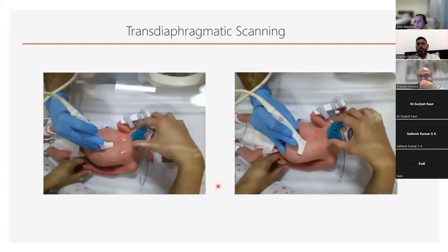Yeah. Okay. So just another example. Again, so this is the left shoulder. So my marker, unfortunately, is towards the left shoulder. It should be the opposite way. It should be pointing towards the right shoulder. Do you get what I'm saying? So we need to turn this probe around 180 degrees so that the marker, which is this end, points towards that shoulder. Personally, between you and me, it'll still give you the same image, but that's protocol for you.